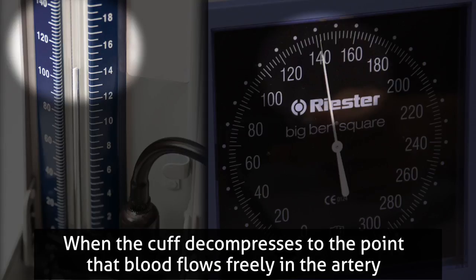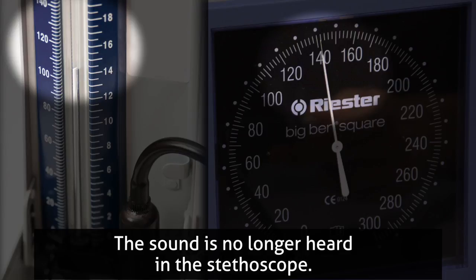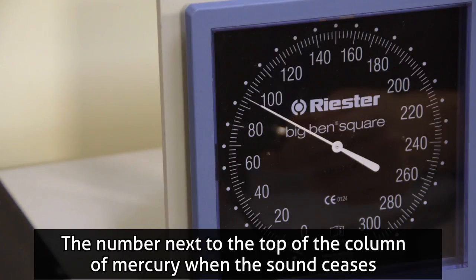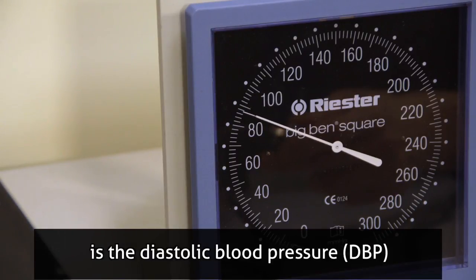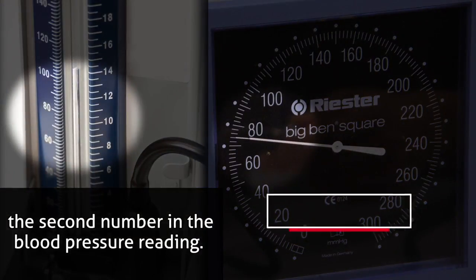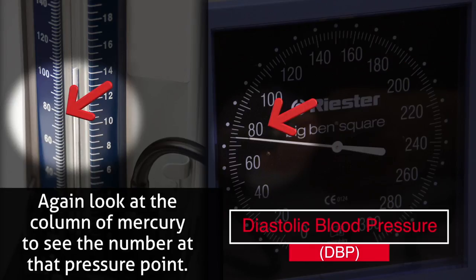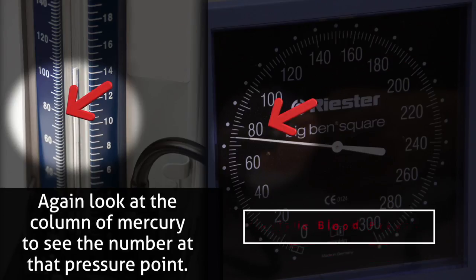When the cuff decompresses to the point that blood flows freely in the artery, the sound is no longer heard in the stethoscope. The number next to the top of the column of mercury when the sound ceases is the diastolic blood pressure (DBP) — the second number in the blood pressure reading. Again, look at the column of mercury to see the number at that pressure point.